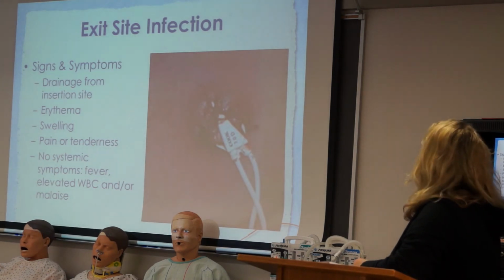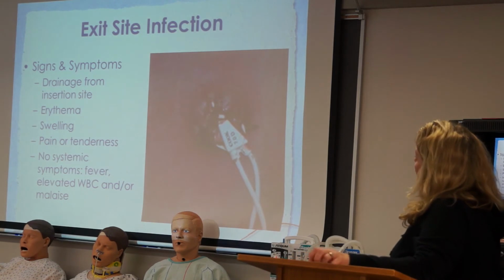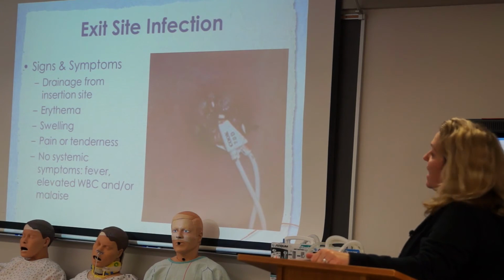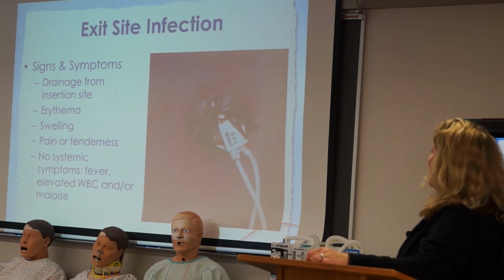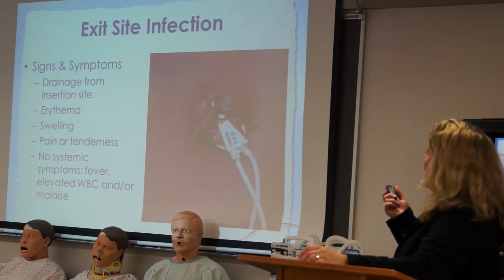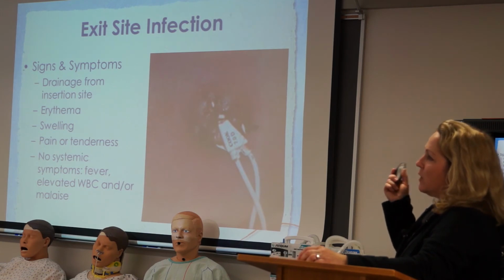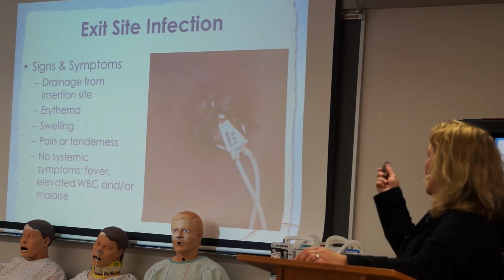Exit site infection. This doesn't show up very good on here, but it's kind of a really ugly infection at the site there. So if you notice that the site is becoming very red, tender, they've got some drainage, pussy drainage especially. They may not necessarily have a fever or elevated white blood cell count, but it's very tender and you can actually see some exudate, and you can tell that it doesn't look good at the site. It's real red and angry looking. In those situations, that probably needs to come out, and a lot of times they'll have you culture that site as well.